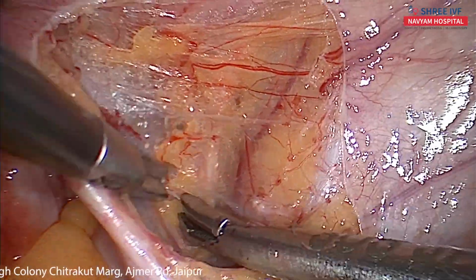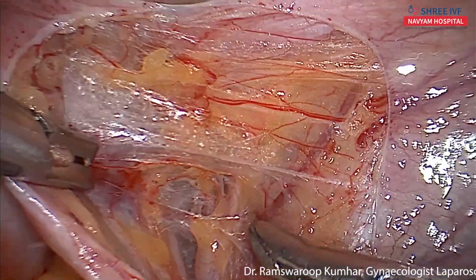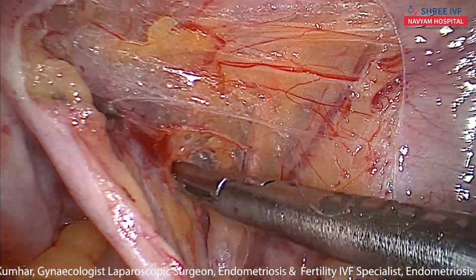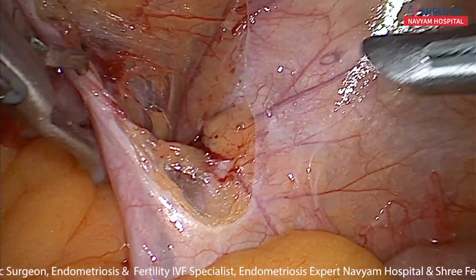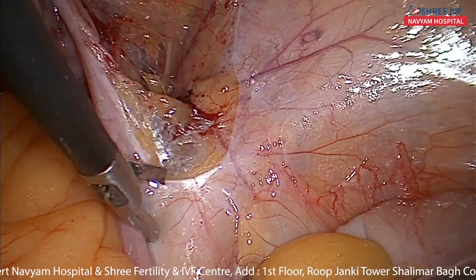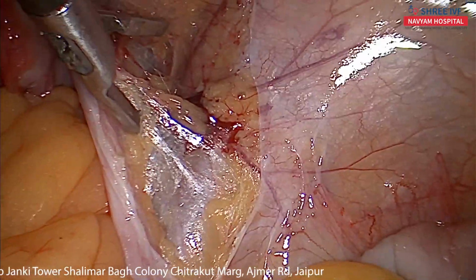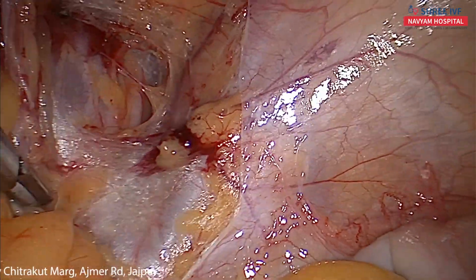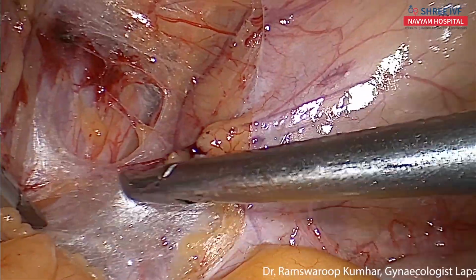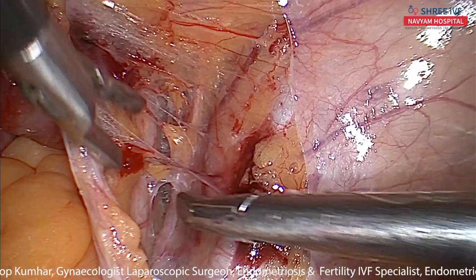Slow dissection is made here, and further, hold this intestine back, and few cuts are made on the back so that the ureter can be easily identified at this level. And we have identified the ureter just below my instrument.